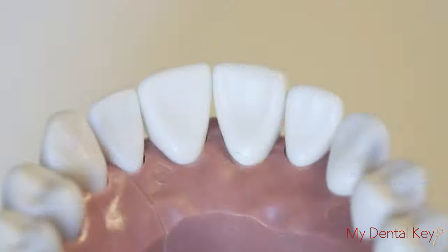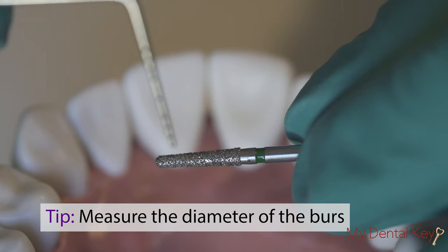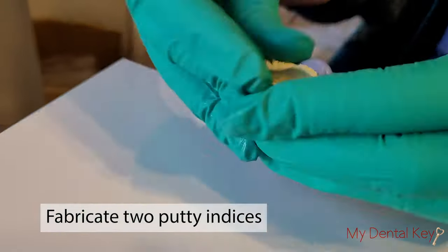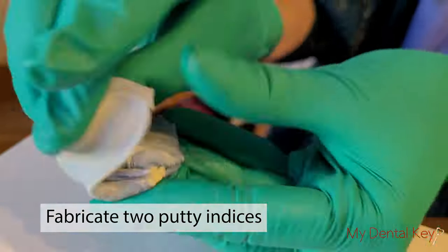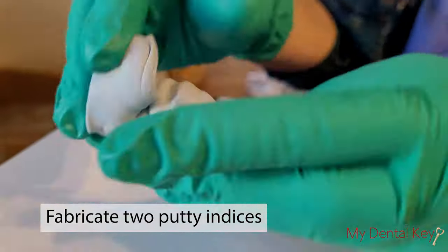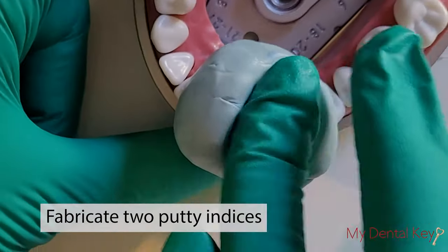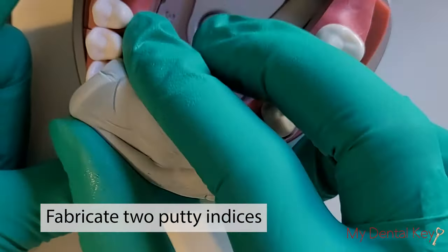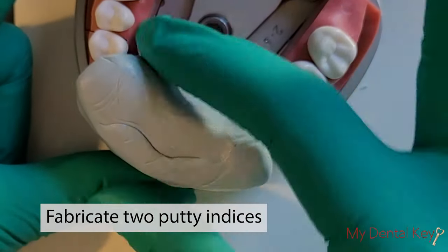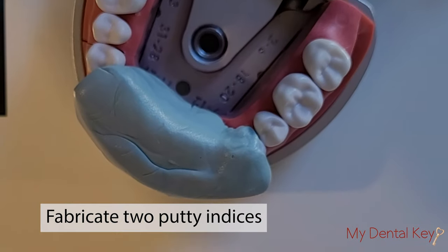As a tip, measure the diameter of your burrs in order to use the burrs as depth gauges in the subsequent steps. To use as reduction guides throughout the procedure, fabricate two putty indices. To do so, you will mix half a scoop of base with half a scoop of accelerator. Knead until the color is uniform and adapt the putty over the labial and lingual surfaces of the tooth that you will prepare. Allow the putty to polymerize for approximately 2 minutes or according to the manufacturer's instructions.